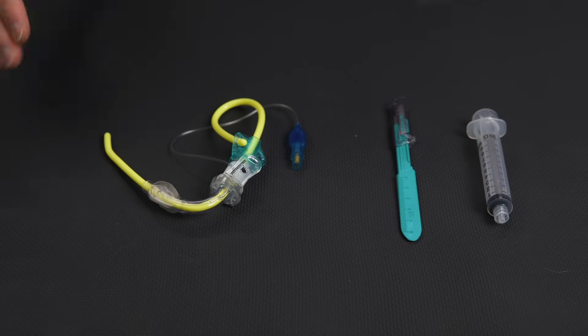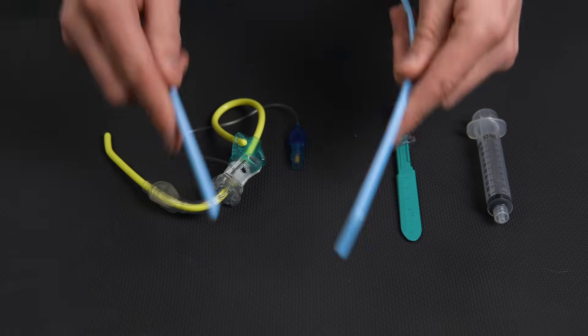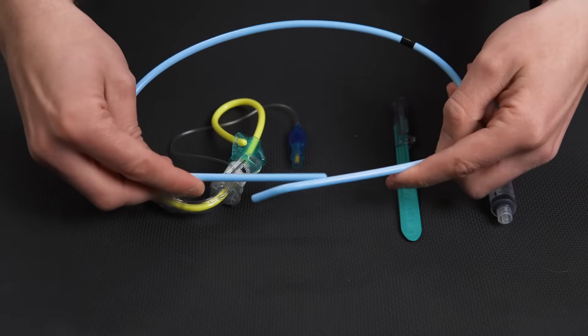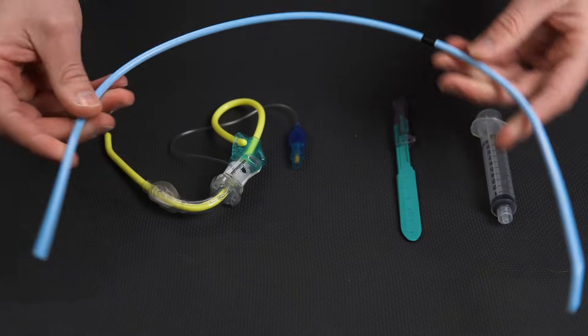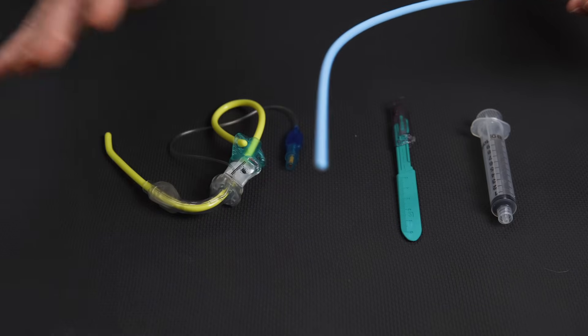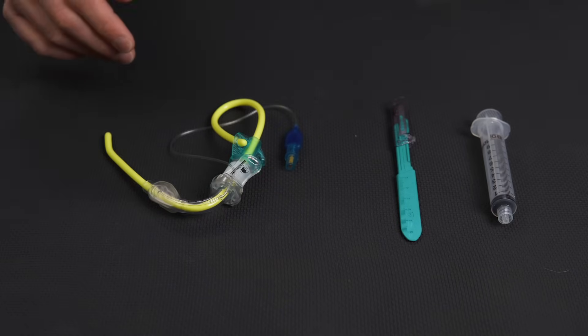One thing to mention here is when you're looking at the bougie to use, you can use a normal adult ET tube bougie. I like the shorter ones for this because it's just a little less cumbersome.